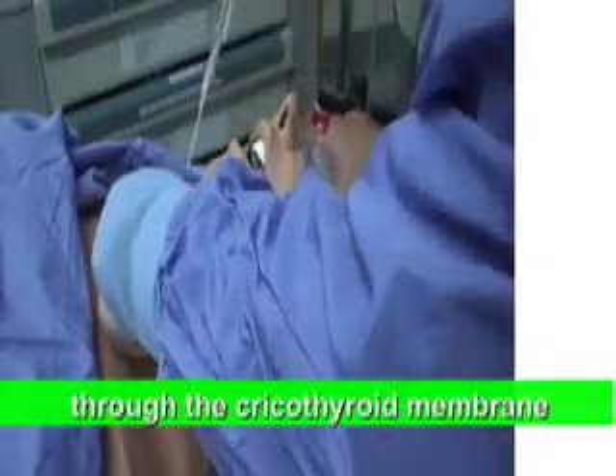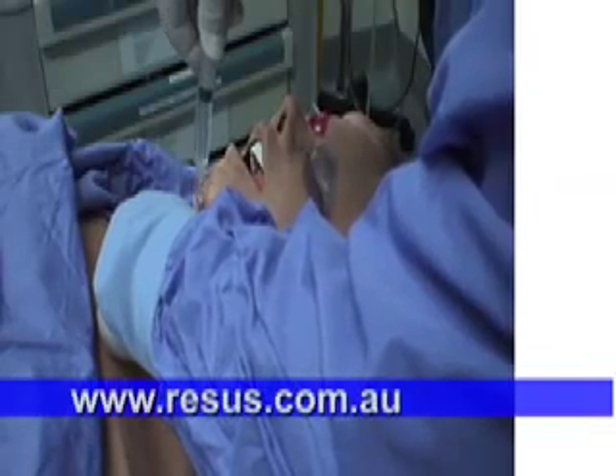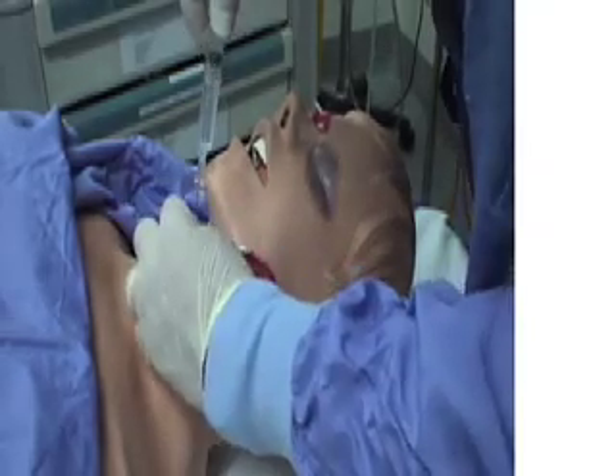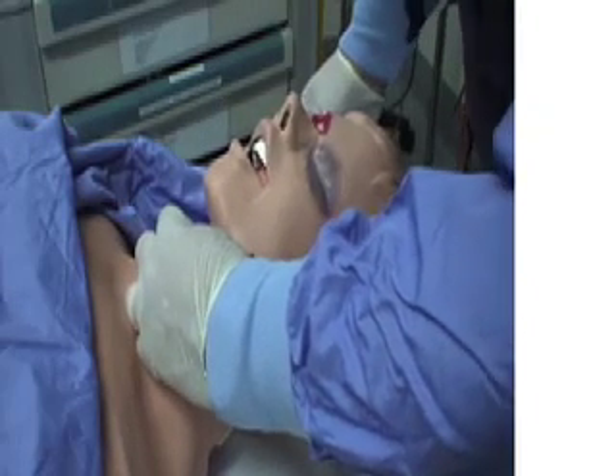We stabilise the larynx and then progress the cannula in while aspirating, and we can see we're in that space. We then advance the hub of the catheter and remove the needle, always keeping our hand on the catheter.